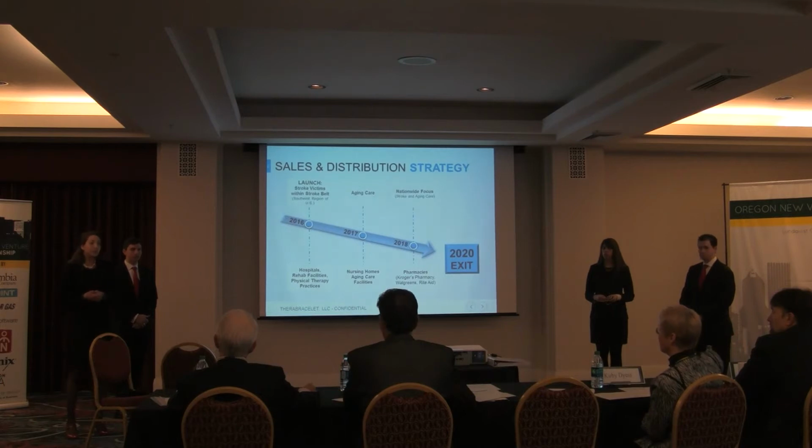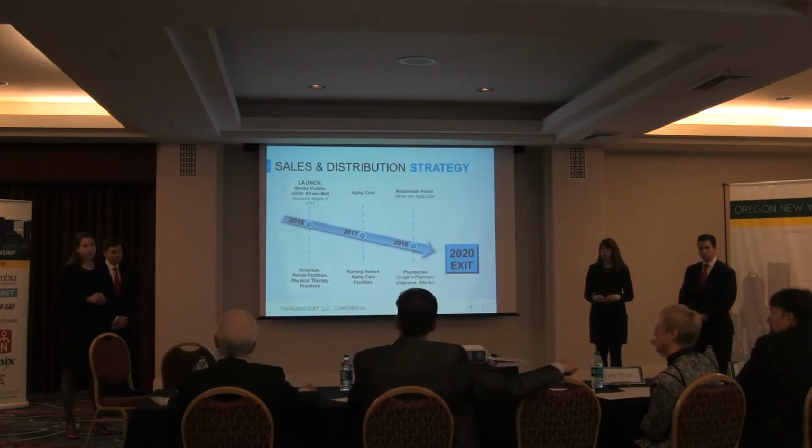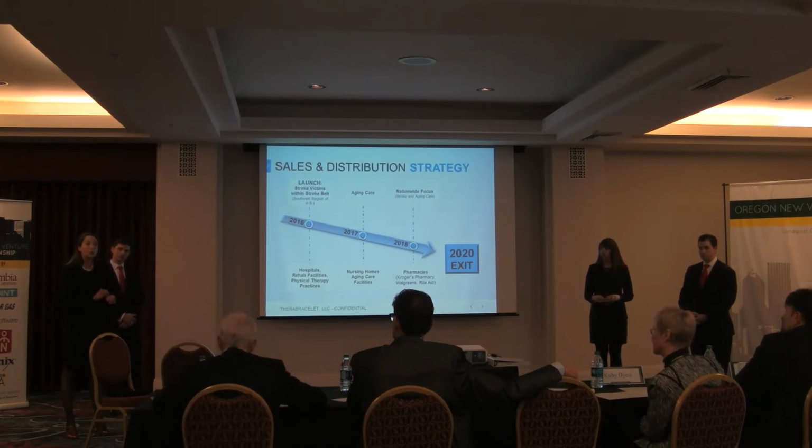One other question on calibration. Is it a one-time calibration, or do you have to recalibrate? Because the calibration goes just below your sensitivity threshold, it will start out there. If you start to be able to feel it again, you will have to go back to your healthcare provider, because that's a good thing. Hopefully it means that you're getting better at that point.